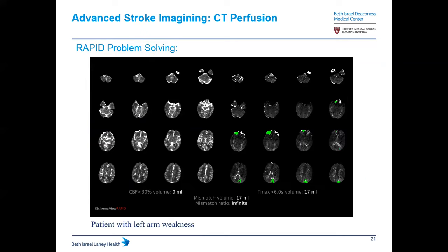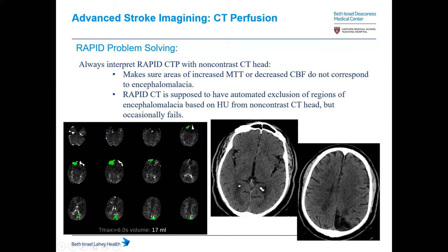RAPID does have problems, and you need to know how to problem solve. Here's a patient with left arm weakness — you can see CBF is less than 30%. But there's increased Tmax in a region that appears ischemic. However, looking at the non-contrast CT, that area is actually a region of encephalomalacia. RAPID is supposed to automatically exclude such regions using Hounsfield units from the non-contrast scan, but the program will fail. This region of increased Tmax corresponds to a region where there's no brain at all.